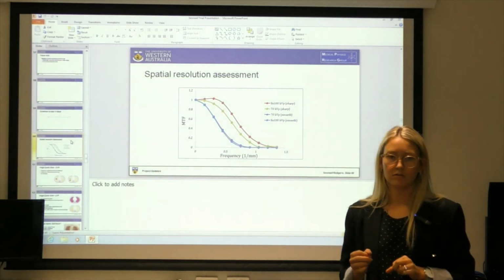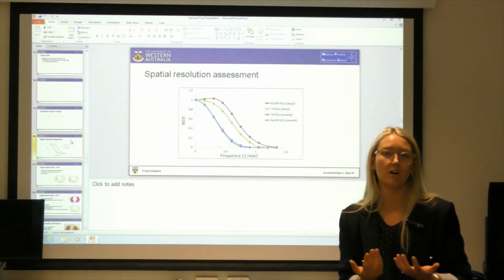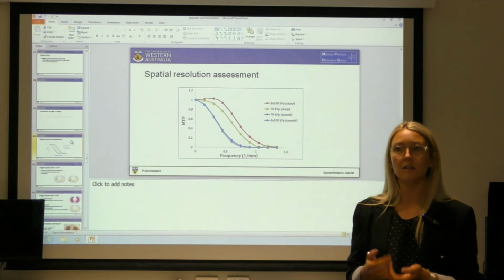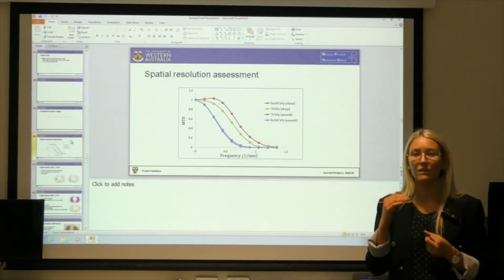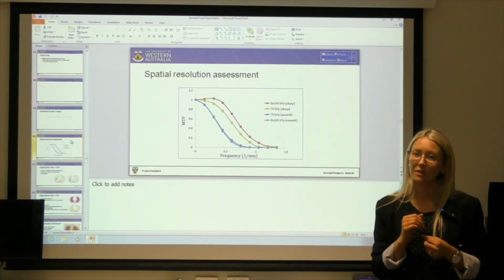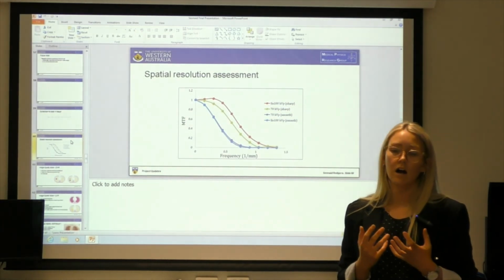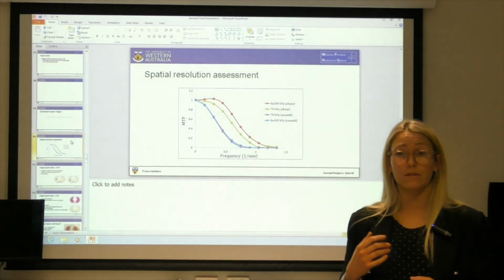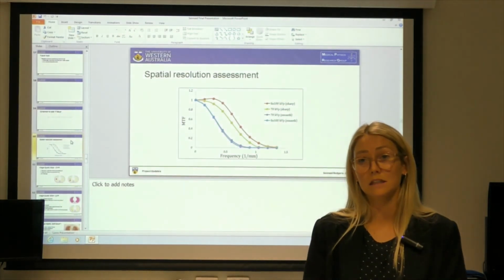However, for general lung pathologies, where you don't know that they've got cancer and you're not looking for that high level of dose and image quality, you can recommend the tin because you can get that dose savings with a slight loss of image quality. So for higher requirements of image quality with the justified increased dose, you would recommend the 70 kVp.